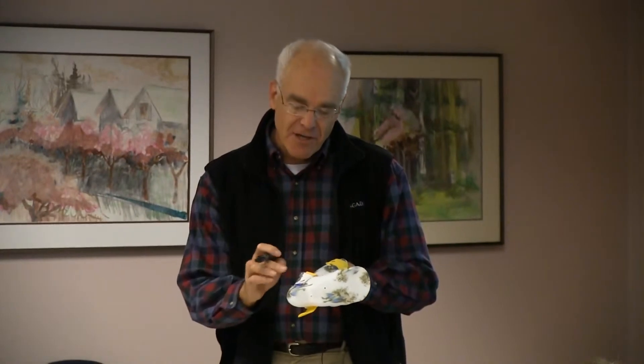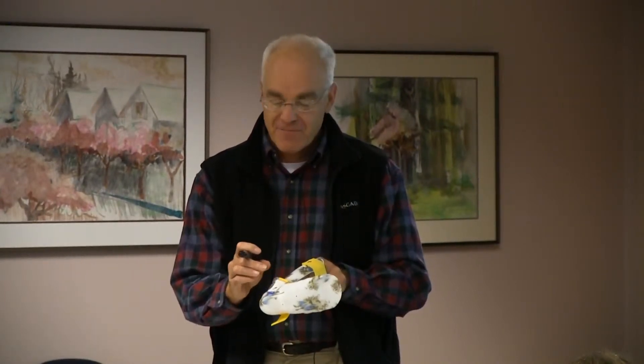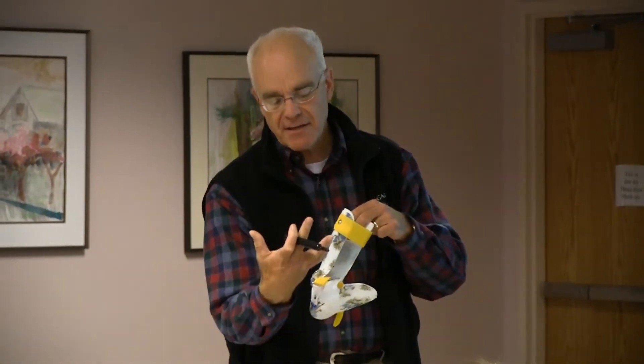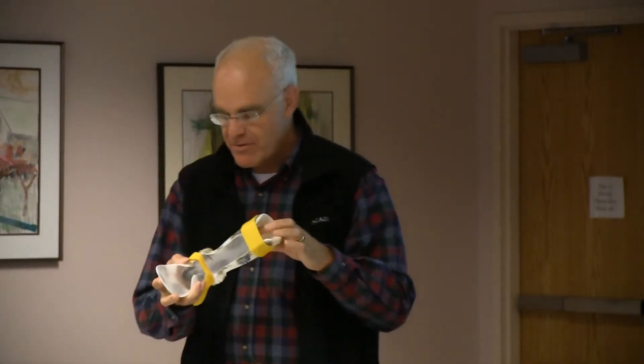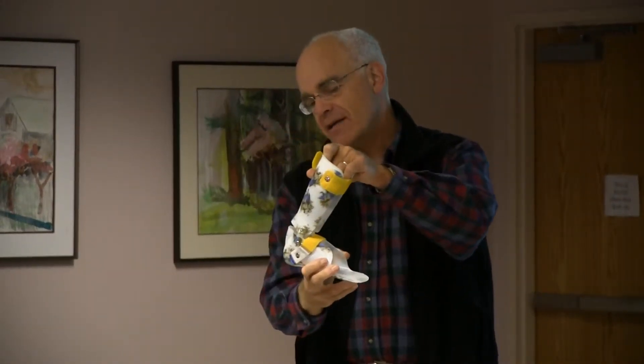The joints are interchangeable — if you took the dorsi assist joint out, which looks like a medium 75, and put a 75 medium straight TAMARAC hinge in, this brace would sit just like that. The dorsi assist is a description of the fact that the brace will try to lift the foot up on swing phase. To tell if it's working, on swing phase you'd see a little opening of the back, indicating the spring is lifting the foot up slightly and increasing dorsiflexion.